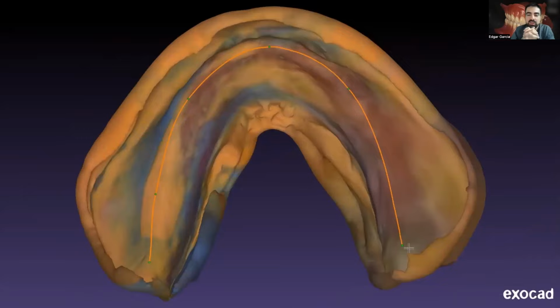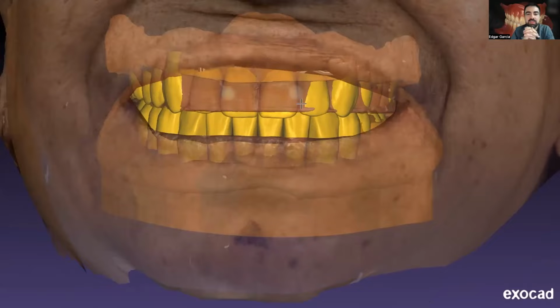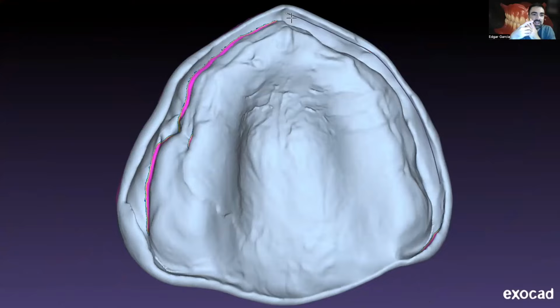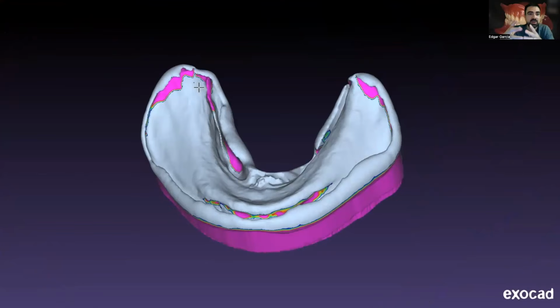You can do a model analysis in an easy way or a little more advanced way in Exocad. The Gerber philosophy is all in Exocad. So everything we know, like when we use the profile compass technique to measure the stop line in the lower ones, is all here. So for me, passing from analog to digital was super easy because it's all in here.